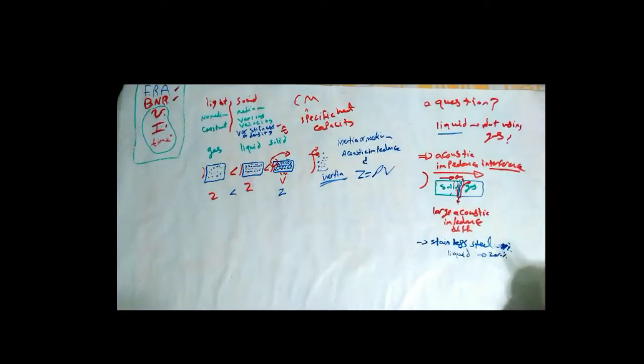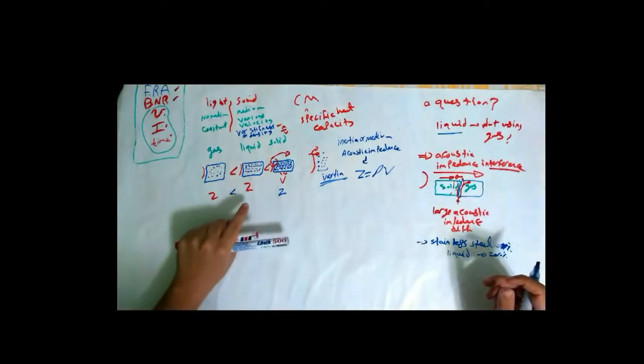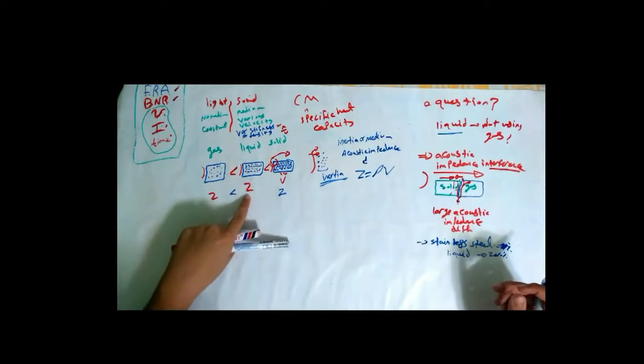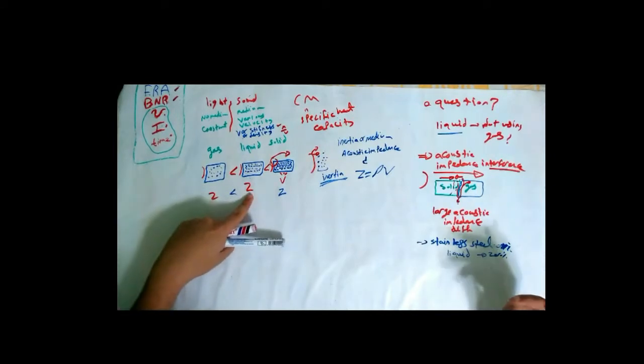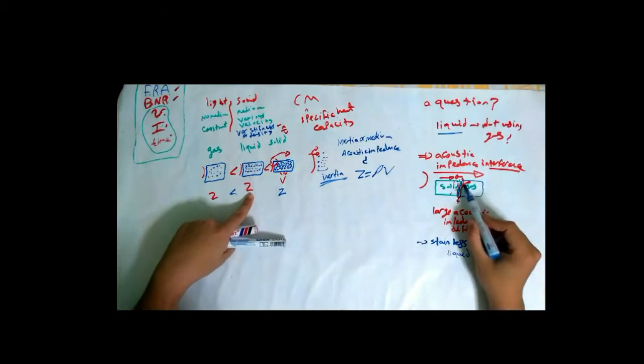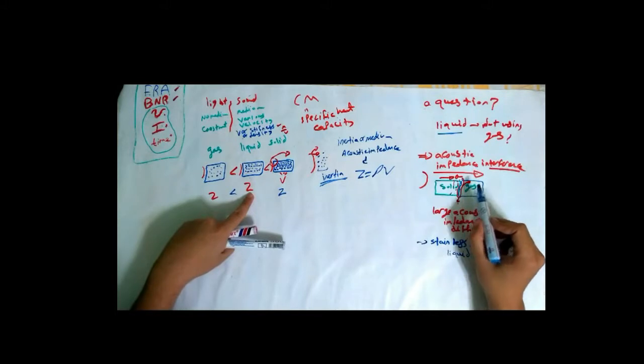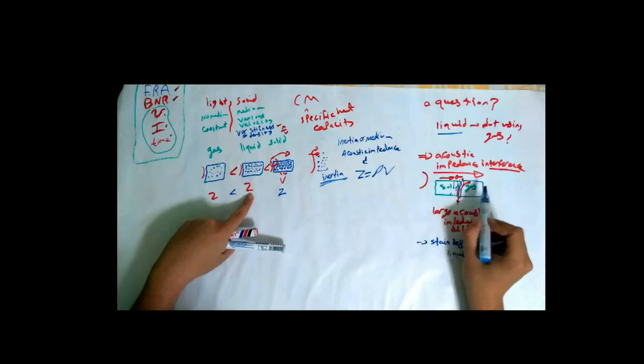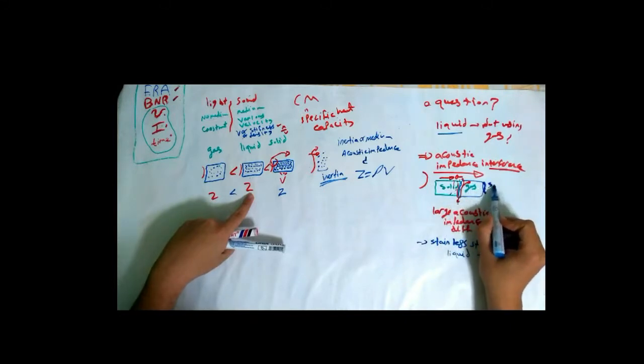So this means that I sacrifice some of the sound energy by using liquid rather than gas, because liquid has higher acoustic impedance than gas, to avoid the greatest amount of reflection and refraction that would happen when the sound wave propagates from the stainless steel transducer to the gas, or from the gas to the skin.